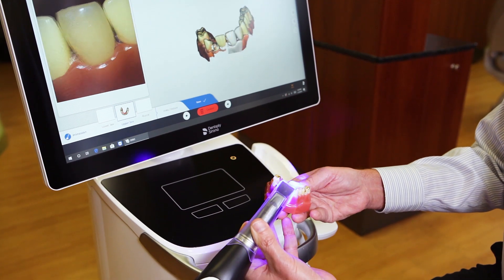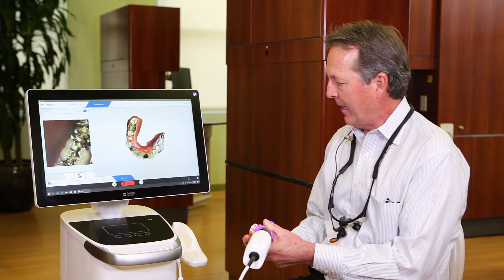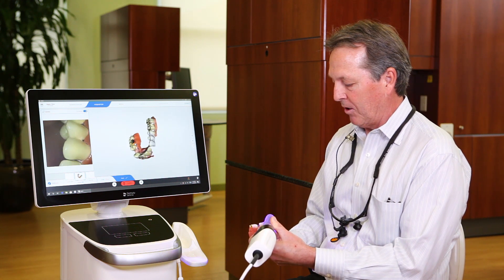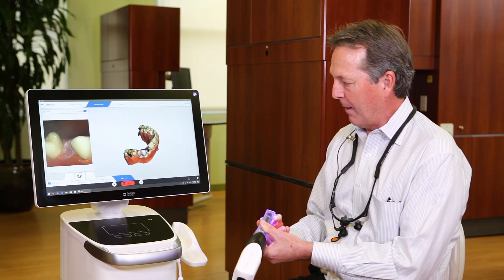Basically just filling in these areas — notice how it's just taking on all of that metal without any complication whatsoever. Easily picking up all the metal, the shiny surfaces, the shiny Emax in the anterior. Just picks it right up without any type of issue whatsoever.